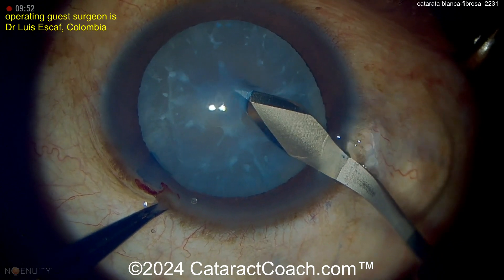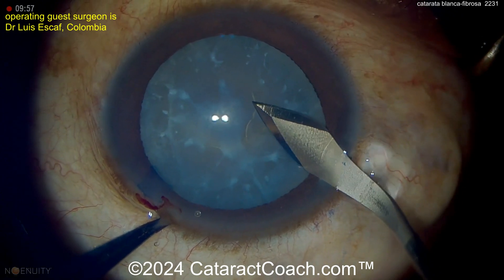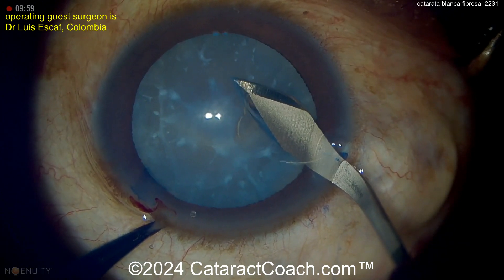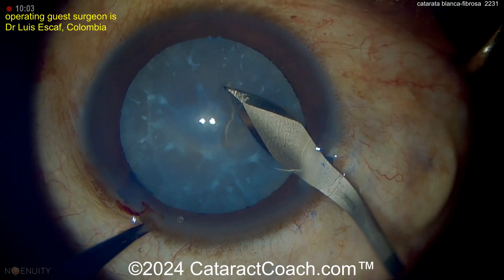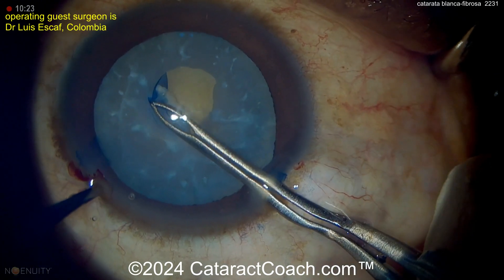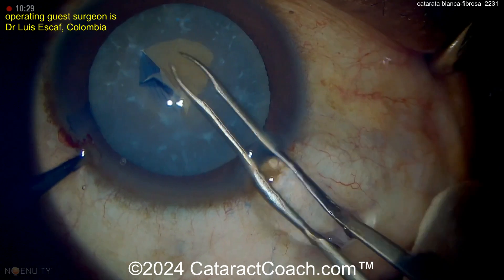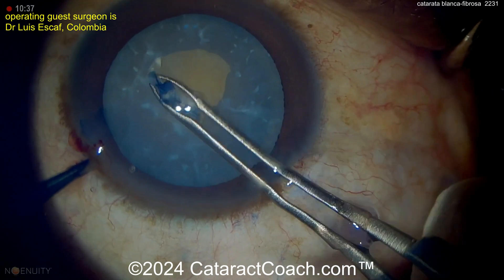Here you can see using the keratome to cut into the capsule. Just by making the main incision, then cutting into the capsule with the sharp tip of the keratome, and getting that flipped over to create the capsulorexis. Now grabbing with the forceps as you create the capsulorexis — look at the undersurface of the anterior lens capsule. You can see there's fibrotic lens material stuck right here into it.